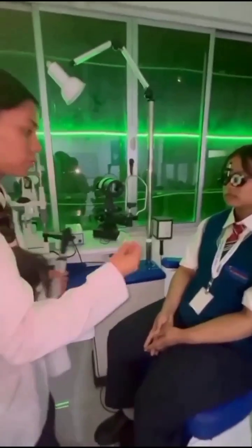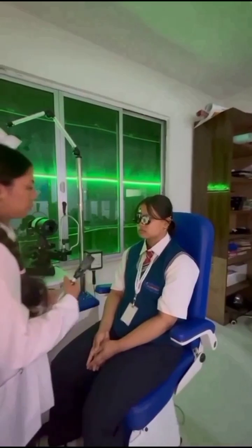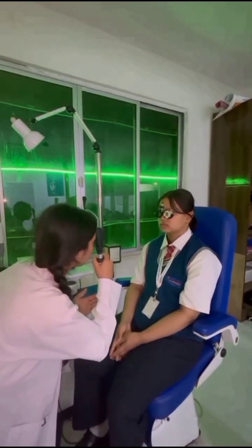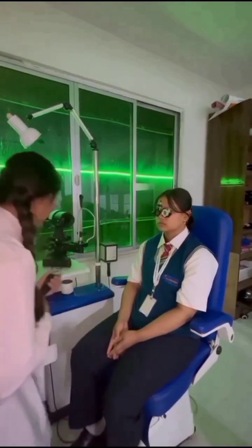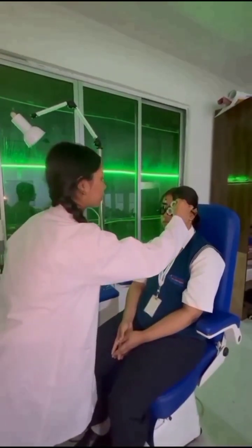So, if we see against movement of the reflex during retinoscopy, it means the patient is myopic and it is neutralized by minus lenses. And if the movement is with movement, then it is neutralized with plus lenses.